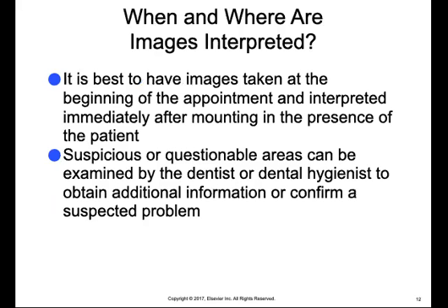So when and where are dental images interpreted? It is best to have images taken at the beginning of the appointment and interpreted immediately after mounting, in the presence of the patient. If any suspicious or questionable areas are seen on the image, the patient can be examined by the dentist or dental hygienist to obtain additional information or to confirm the suspected problem.